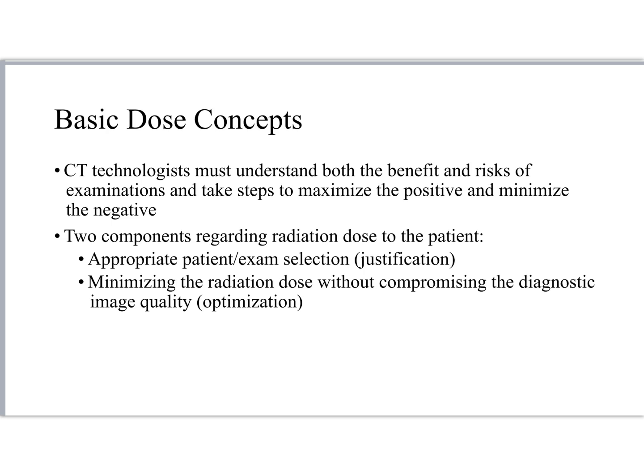justification, that is ultimately the purview of the interpreting physician, the radiologist. So if we see a CT patient that looks questionable, the place where the buck stops is going to be the radiologist. We need to go and talk to them about, hey, I noticed we're doing this CT of the elbow on a 6-month-old kid, right? Do we really need to be doing this? And that justification question is best addressed by the radiologist. But what we can do, and where we should really sit in the captain's seat, is the question of optimization.